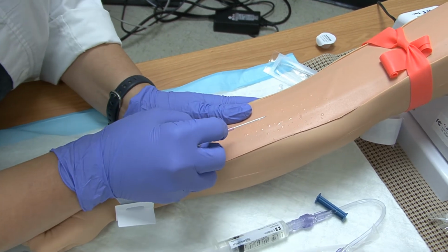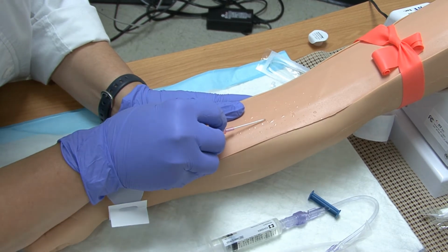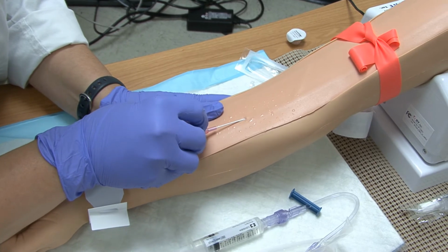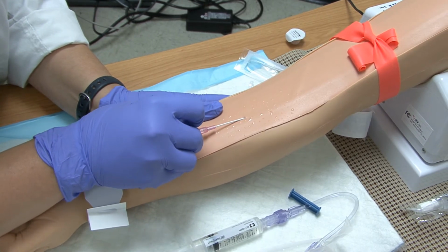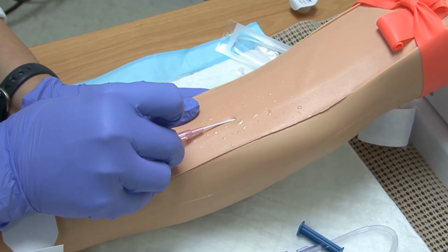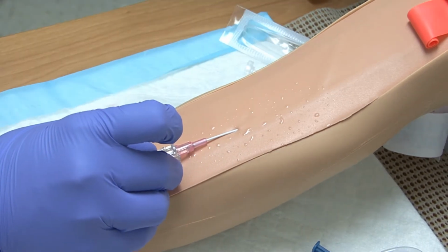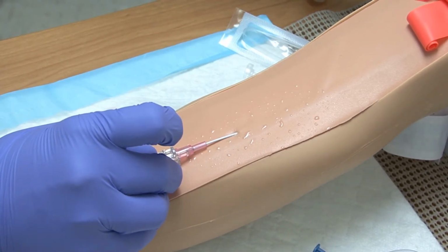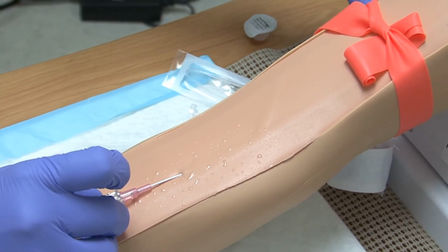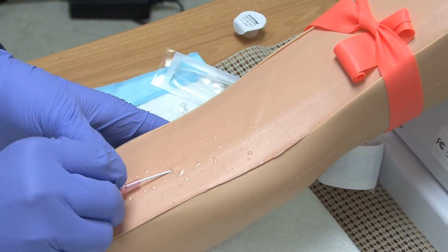So you need to make sure you can see the vein and you're visualizing. I'm going in at a 10 to 15 degree angle, so I'm going to pierce the patient's skin. You would want to prepare them and let them know that you're doing this. As I'm entering, I'm going to go ahead in. And what I'm watching for is flash in the catheter. And we'll see if we get it. Sometimes on the task trainers, you may or may not get flash in the catheter.